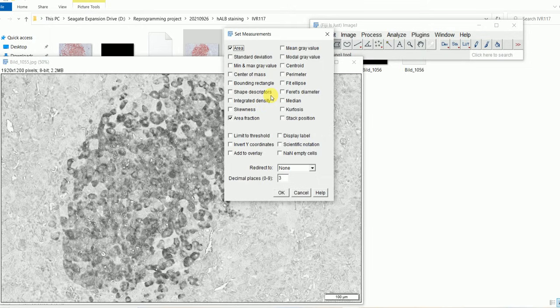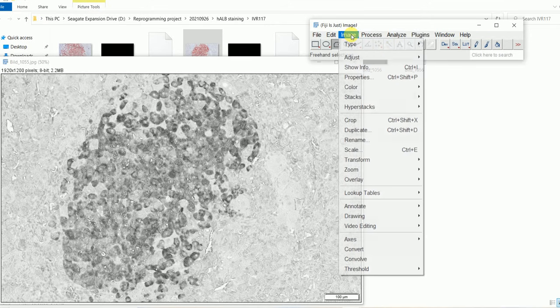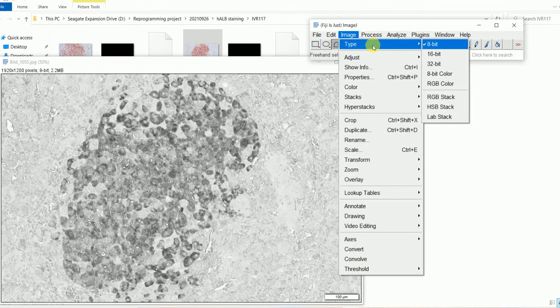Here in this pop-up box, you can see that Area and Area Fraction have already been checked. So you have to check Area, and you also have to check Area Fraction while you are setting the measurements for the quantification of these immunohistochemistry or immunofluorescence images. So check Area and Area Fraction, and then I'm going to press OK. Right, so this has been set. Now the image has already been converted to an 8-bit image. Okay, Image, Type, 8-bit, this I have already done.